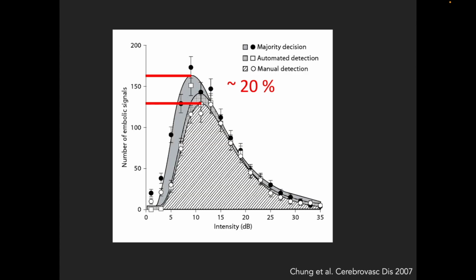Now let's look at some technical aspects, and the first will be, how can I hear a microembolic signal best? The first step in detecting a microembolic signal is hearing a signal intensity increase. It has been shown that this is best done in a silent environment, which of course can easily be created by wearing a set of good headphones.